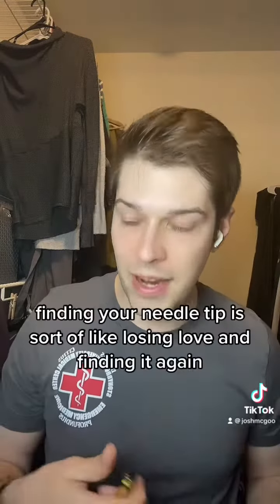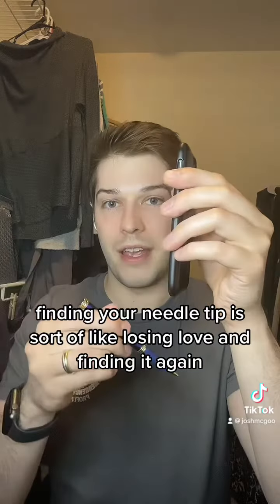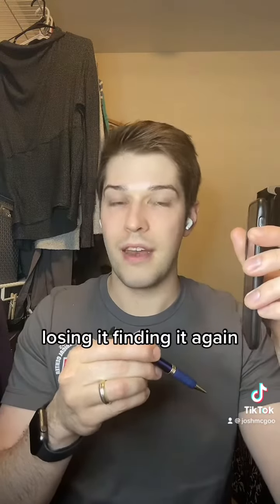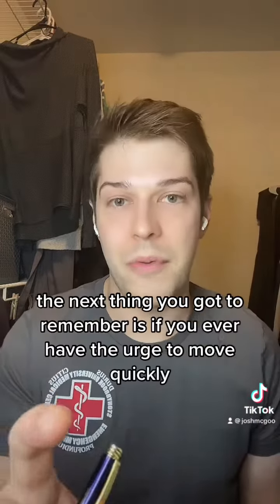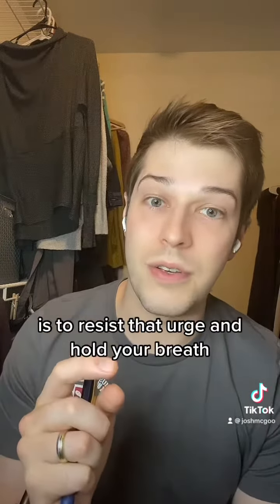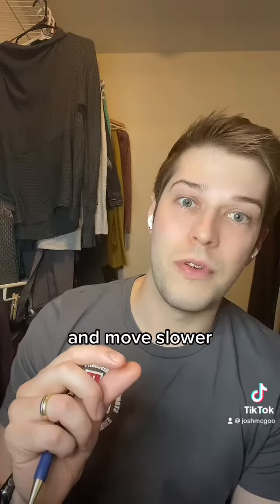Finding your needle tip is sort of like losing love and finding it again — losing it, finding it again. The next thing to remember: if you ever have the urge to move quickly, resist that urge, hold your breath, and move slower.